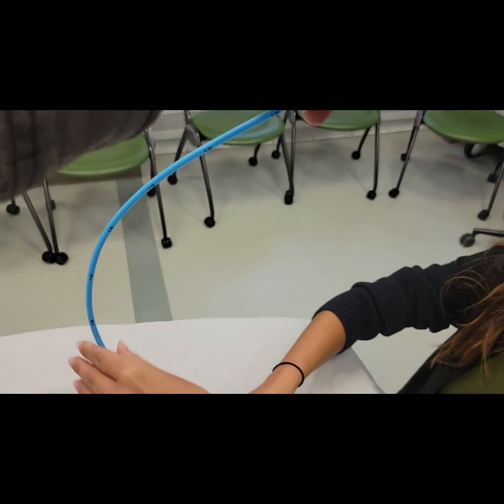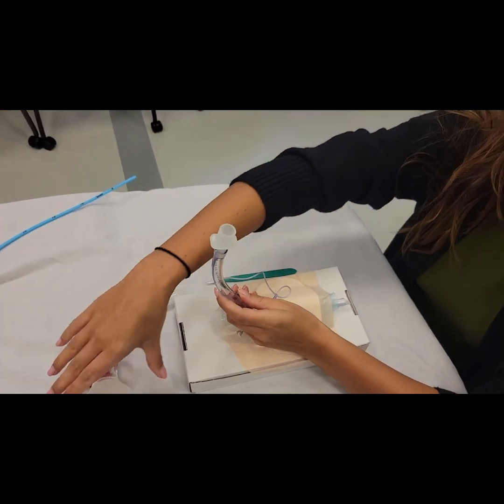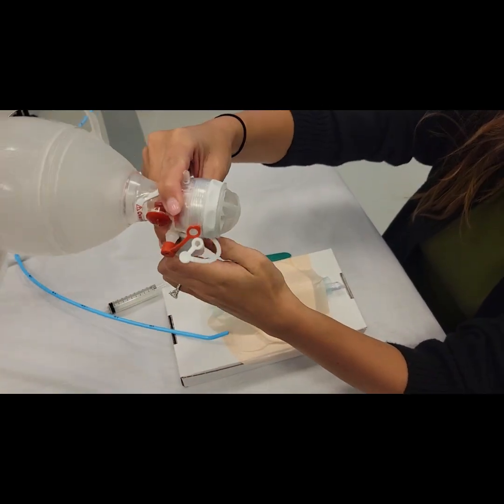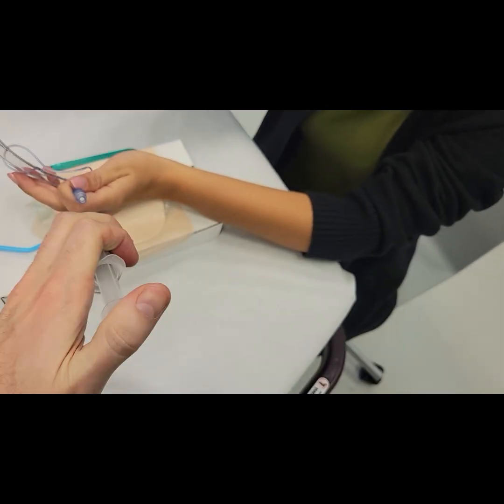Then you remove your bougie, and you can start bagging, and someone can help you inflate.